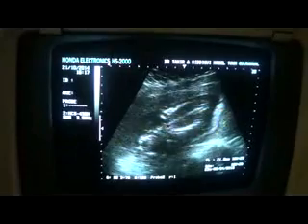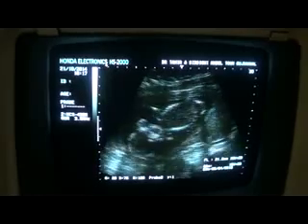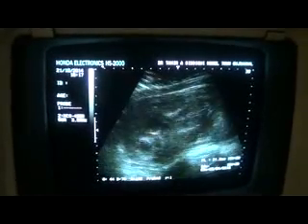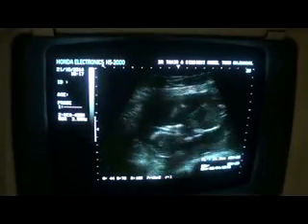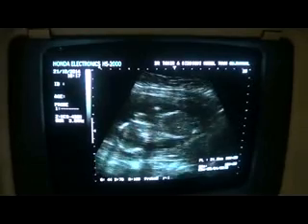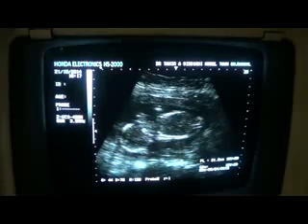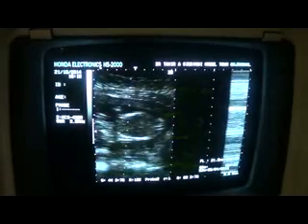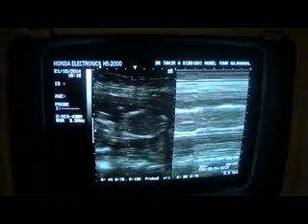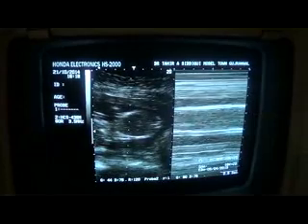the fetus. You can see the cardiac flicker. Transverse lie. Here you can see the cardiac flicker. So, single active alive fetus with cardiac activity. You can see the waveform.